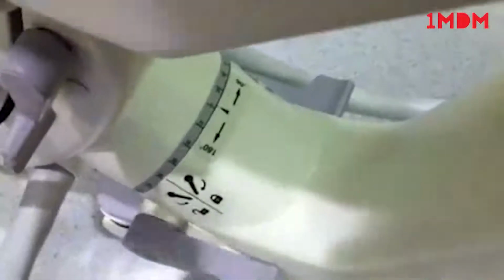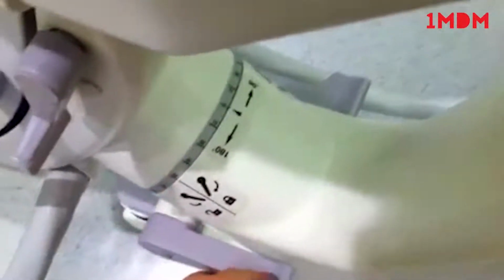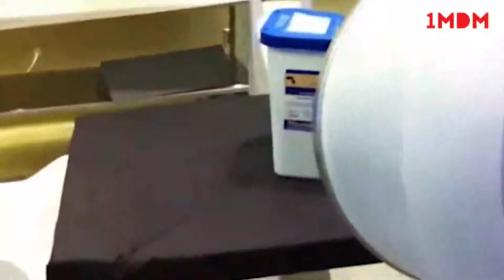But after you're done, make sure to put it back in the 0 position. And turn this one back so that it's in its neutral position here. Okay, there we go. I'm going to flip it back up now and get this back into an AP position. See what I mean about hitting the table?